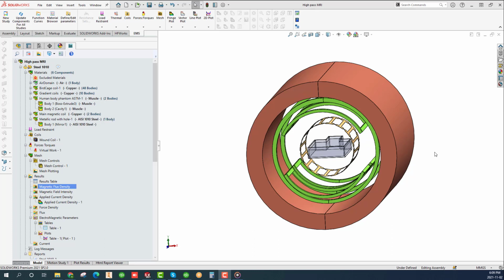Magnetic resonance imaging, or MRI, is a powerful imaging technique to obtain detailed images of organs and tissues throughout the body without the use of X-rays or the so-called ionizing radiation. Unlike X-ray and CT scan, MRI produces no ionizing radiation. Hence, there is no limit on the number of MRI scans a patient can have in a given year.